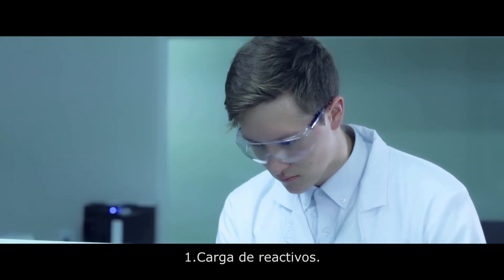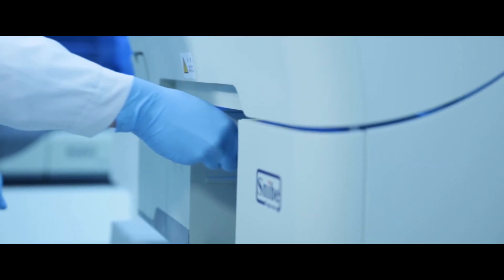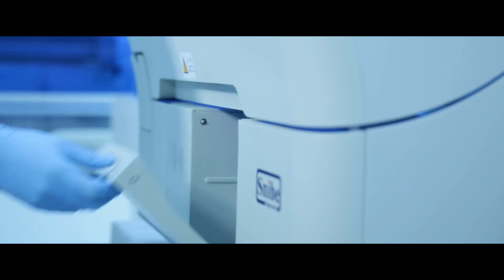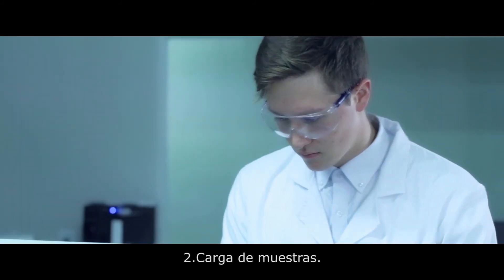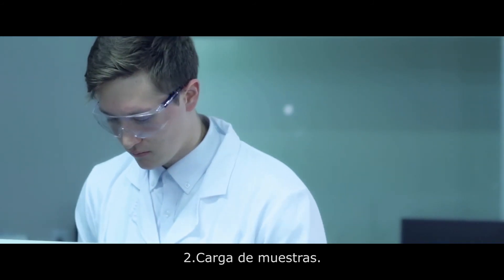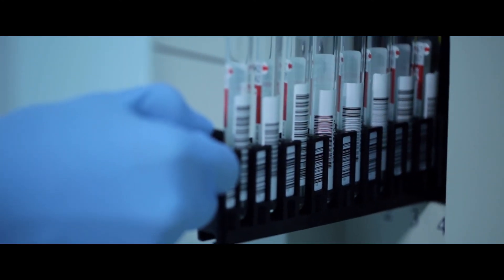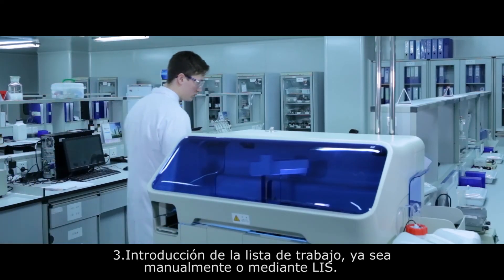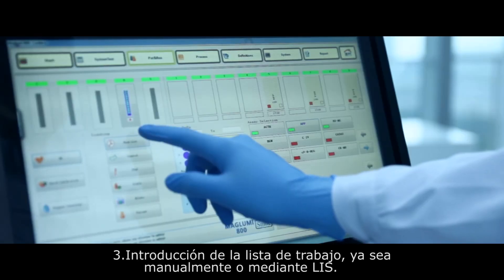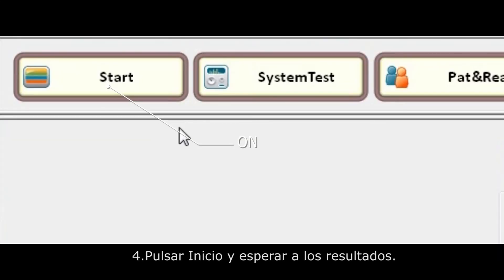To review the main steps: one, the user loads the desired reagents; three, the desired work list is input either through LIS or manually; four, press start and wait for the results.